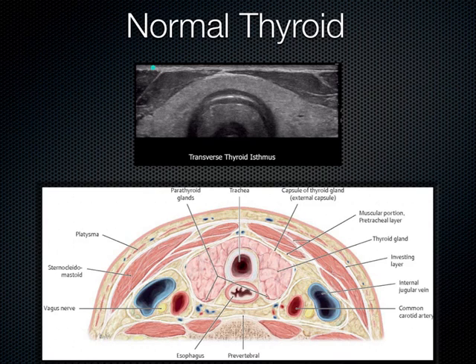And the anatomy couldn't be more obvious on ultrasound. It's right up next to the edge of the transducer, so we can have a nice high-frequency linear transducer here identifying all the thyroid. This is the trachea. And we see the mirror image artifact of the thyroid isthmus. This is the isthmus of the thyroid. We see the mirror image on the other side of the trachea right here. So that's just the mirror image of the isthmus down here, not actually in the trachea, but that's how it looks because of the physics of the situation.